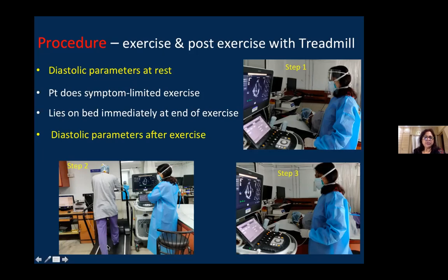Then I ask the patient to walk on the treadmill, and the patient does the symptom-limited exercise. As soon as the patient becomes short of breath, the patient immediately lies down on the bed in the left lateral position. And again, I take the diastolic parameters after the exercise.